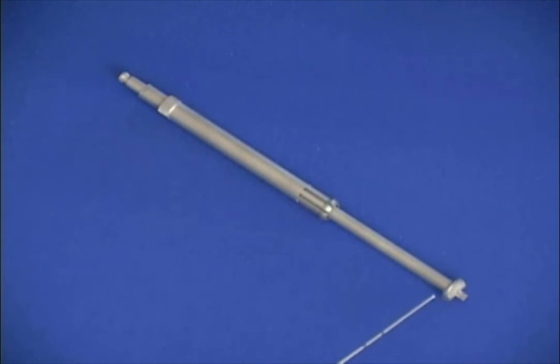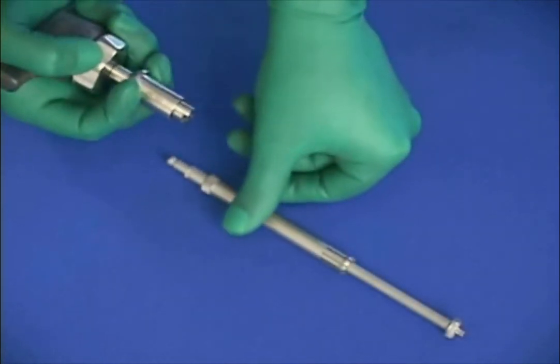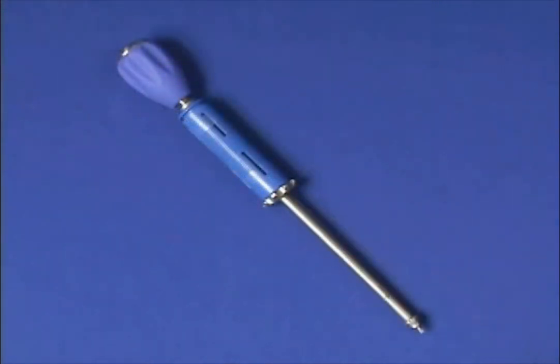The distal tip of the quick driver is first loaded into the head of the screw, after which the collet is pressed into the head of the screw to lock the screw to the driver. The instrument is released from the screw by upright pressure or by manual release of the collet from the screw head. The quick driver is loaded into and released from the ratcheting T-handle by pulling back on the Hudson fitting of the T-handle. The locking screwdriver rigidly attaches the driver to the screw to accommodate techniques which direct the screw through side loading of the instrument.